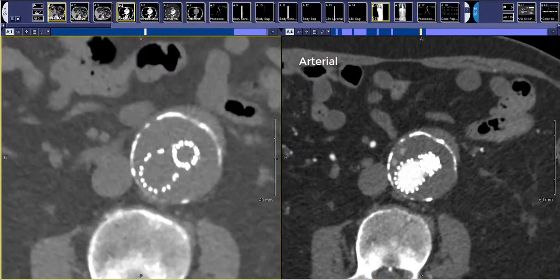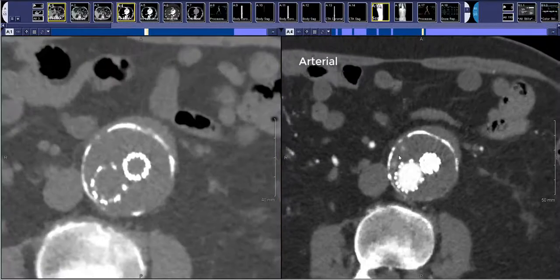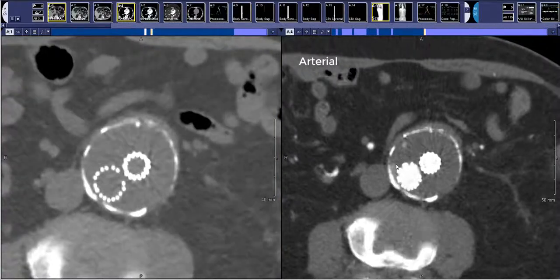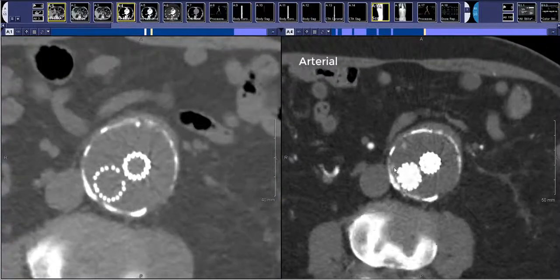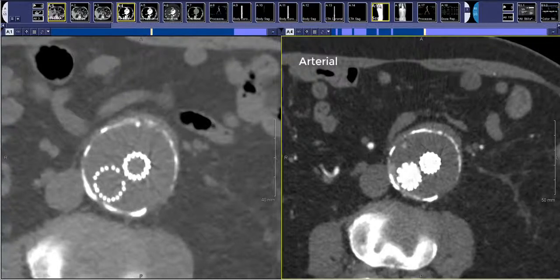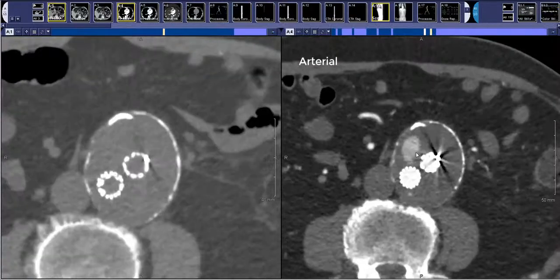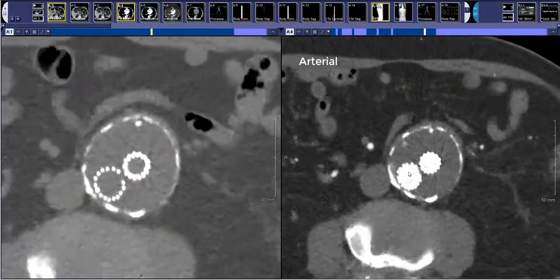Zooming in on this phase, what you're looking for is the excluded part of the aneurysm and to see if there's any high attenuation contrast material. We can verify that this is not in fact calcification because it does not appear on the non-contrast scan. So that's what an endoleak looks like. In this case it was likely a type 2 endoleak.